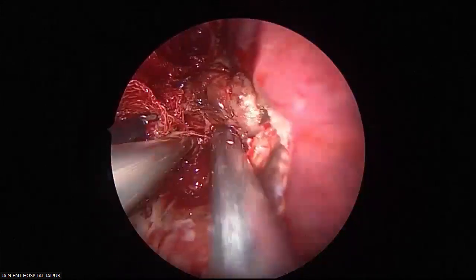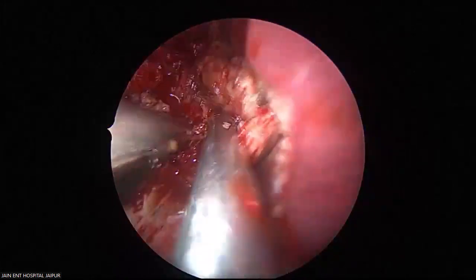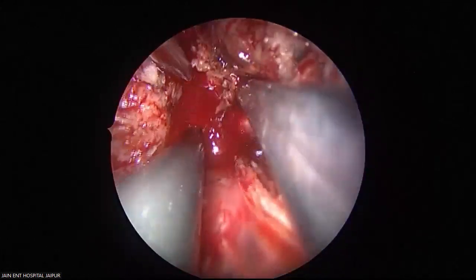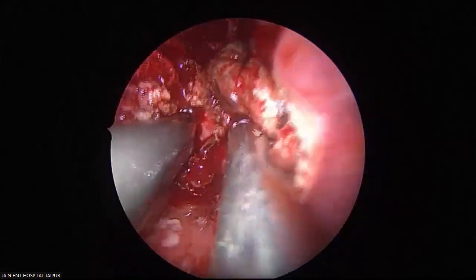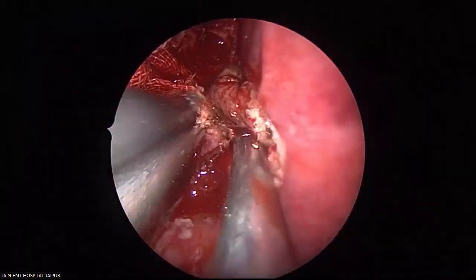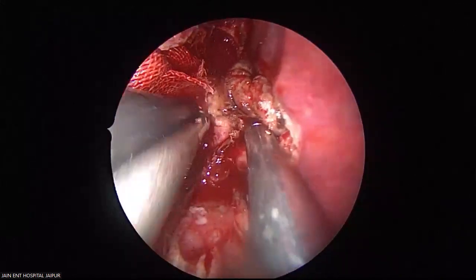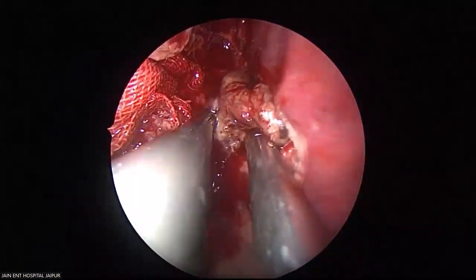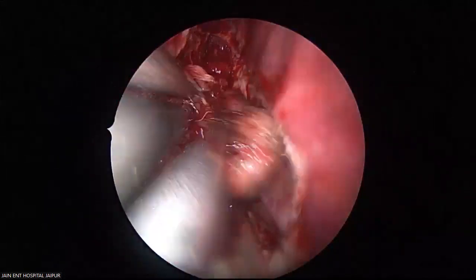Now you are separating with coblation, lateral to medial. Accepting a little bit of the bleeding which we will tackle, I am doing this planned division. Yes, yes. At the edge of this, see the bone there inferiorly. See the bone? This is a proper planned division.